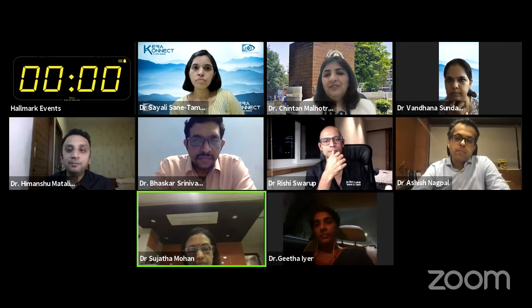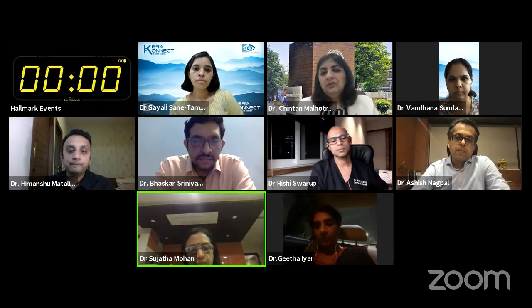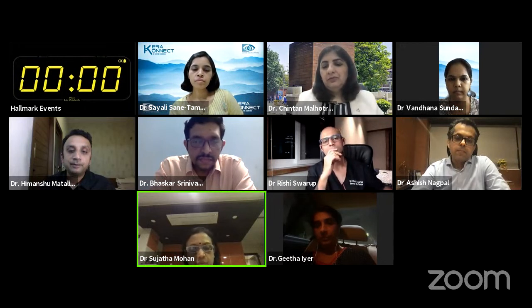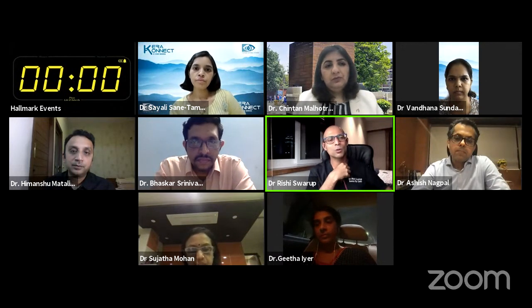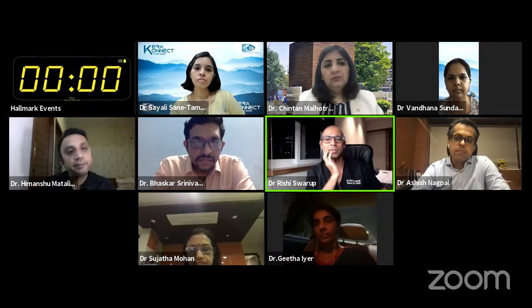Non-contact. We do non-contact for all patients at every visit. Anything more than 12, and I would be suspicious because they expect a low IOP in patients post-LASIK. Yeah, I think non-contact is a fairly good screening tool. It gives you an idea of where you are. And if you see something high on NCT, then you can investigate further.